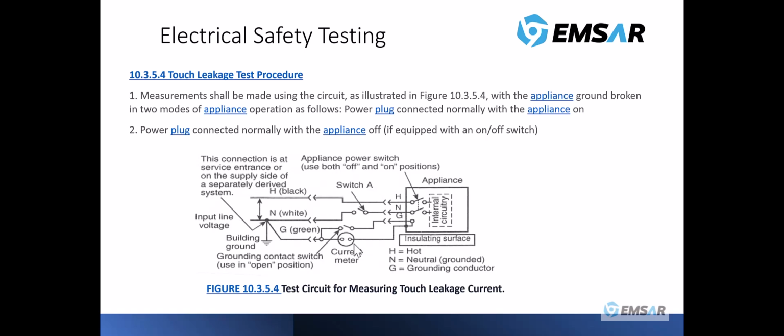So to measure something that's in a surgical suite, look for an outlet, because if it's a newer suite, they may have a grounded outlet in there for that purpose. Otherwise, we would need to either remove the device and move it to an area where we can test with a grounded outlet, or we would need to let the facility know that we're using an extension cord to test, and that we will be sure to remove that extension cord when we leave the work area. Now, this is for future reference anyway, because when we start working in standalone surgery centers.